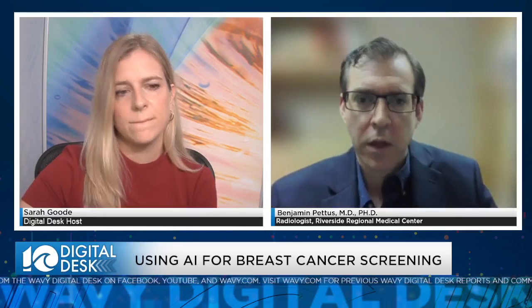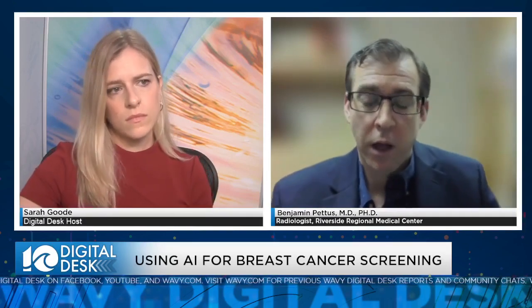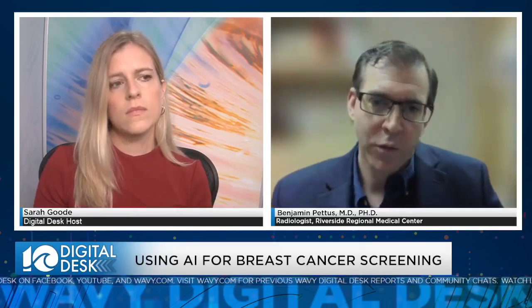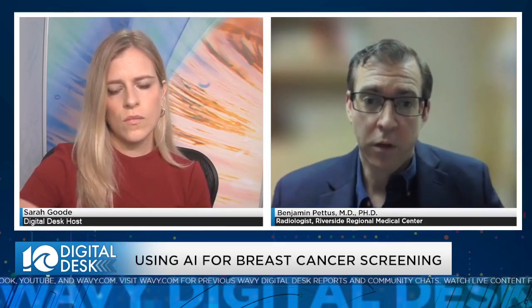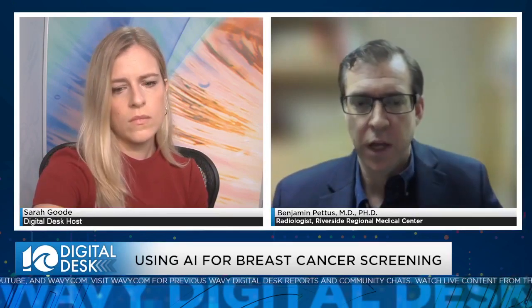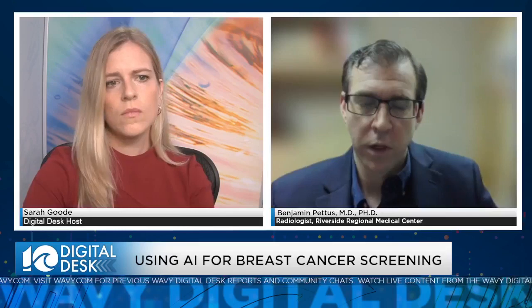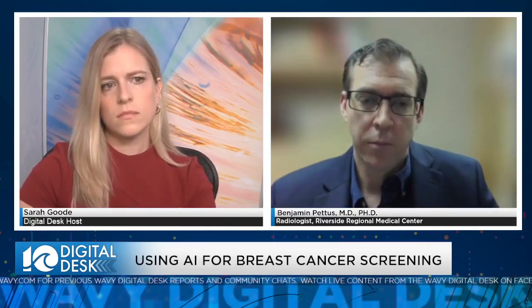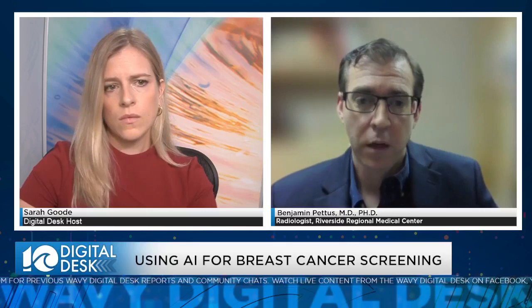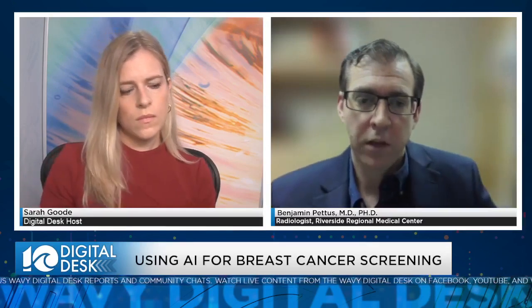For me, the easiest way to understand it is it's kind of how they're using the power of computing. It used to be that you could just program a computer to do what you wanted or the input, but now they have ways to basically feed a lot of information through a system and make sure it's giving the sort of output that makes sense or that is wanted. So in this situation, what they've done is they've taken 1 million cases all around the world, different locations, Europe, US, different ways of doing 2D or 3D mammography, different vendors, and they've filtered it through a system that's enriched with a lot of cancers to train the computer to detect the shape or size and features of a cancer.